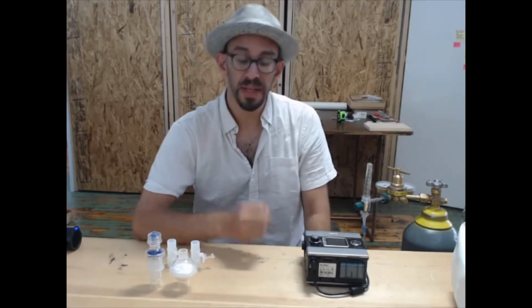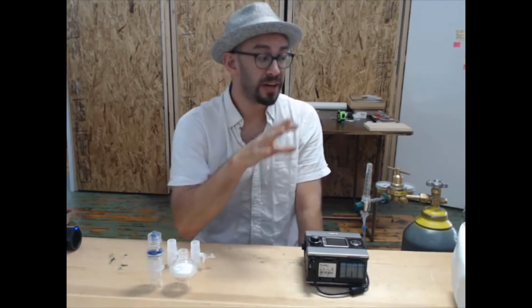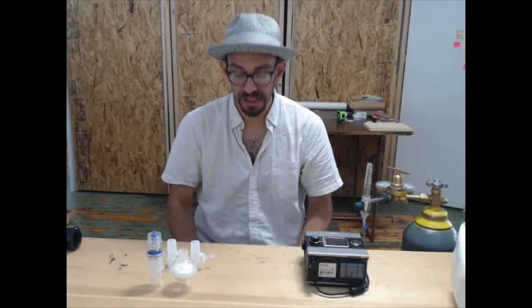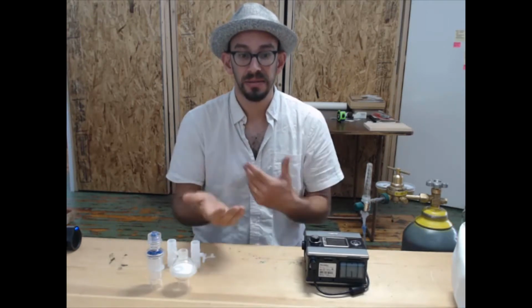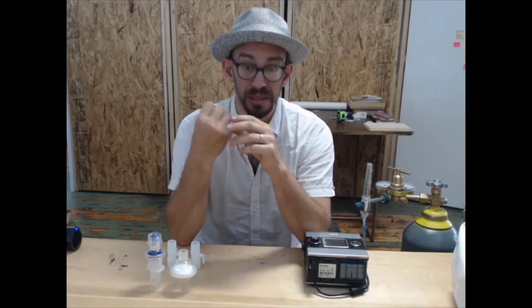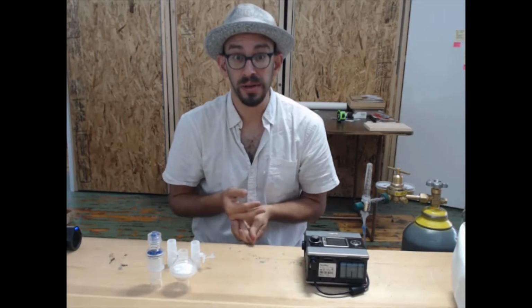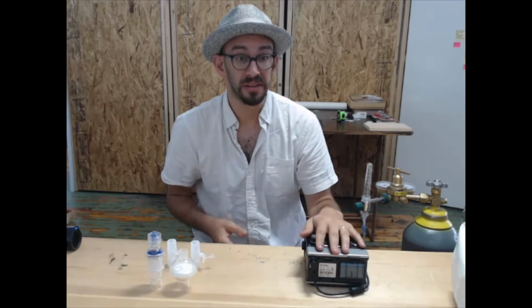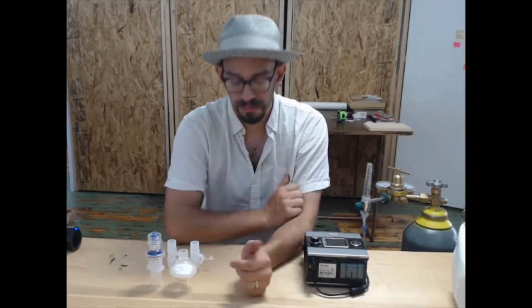However, if your patient is in the low to moderate range of respiratory illness, this can be a very good and adequate treatment for that patient. It's a non-invasive treatment, so there's less disruption to the patient's body, and it can be used to increase low blood oxygen saturation and to recruit alveoli by providing different levels of PEEP to your patient and working with patients that have a high work of breathing or that are very undersaturated.